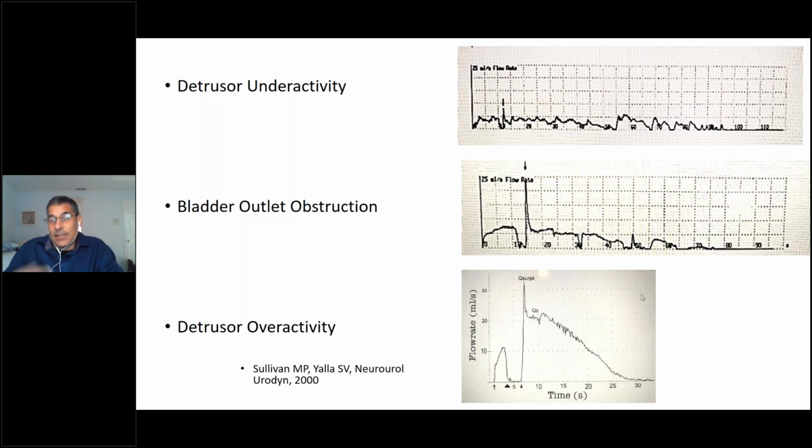You can also see that you're going to get a high Q surge with detrusor overactivity because when you have overactive bladder, in other words, spasms, and you don't want to wet yourself, you're going to clamp your urethra, the guarding reflex, and you're going to have this isovolumetric contraction. So you're going to get a big surge. But what makes this different is your steady state flow is high. It was 20 mLs per second. So we could diagnose detrusor overactivity based on uroflow.